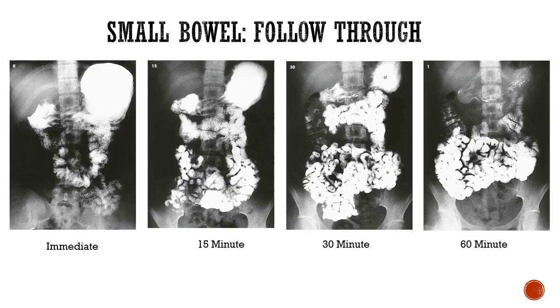So here's an example of a small bowel follow-through where we have the immediate image taken, a 15, a 30, and then a 60 on the same patient. And we do use time markers.